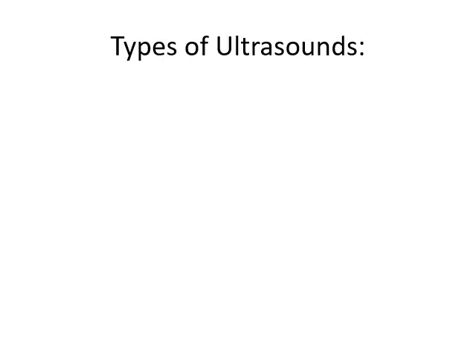Okay. So what are the different types of ultrasounds? Now again, I'm going to give you 5 general types of ultrasounds. We're not going to get into all the details of all the fancy different ultrasounds, and there are more. So these are the basic ones. One of the first ones you'll go for is just the general ultrasound that we're talking about, where they'll put the probe on the outside of your body and they want to see what the organs are like on the inside. So that's just your general ultrasound. It doesn't really have a fancy name. I'm sure it does, but they just call it general ultrasound.